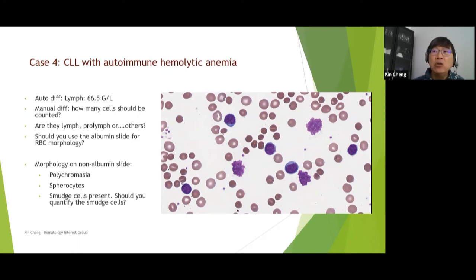But if you don't do proper screening, you may miss that the patient actually has some neutrophils, maybe not as many, but you should still report occasional neutrophils, because that will indicate the patient may still have some defense mechanism there.